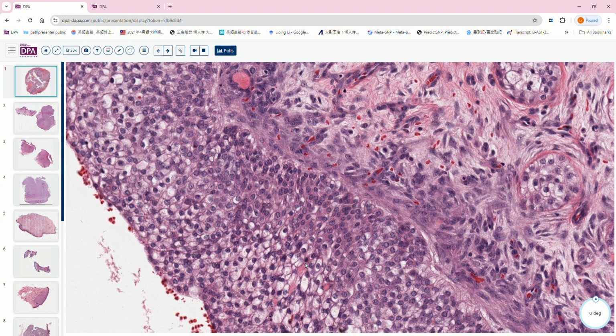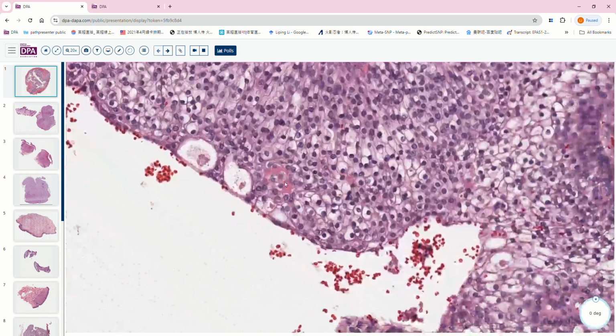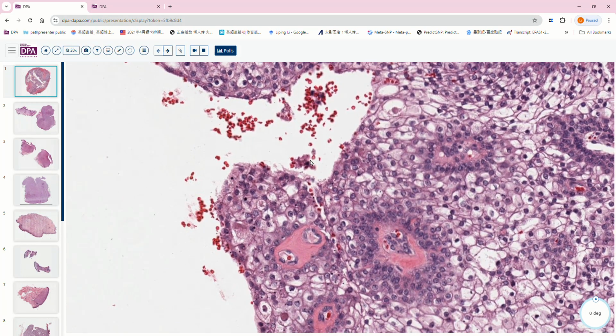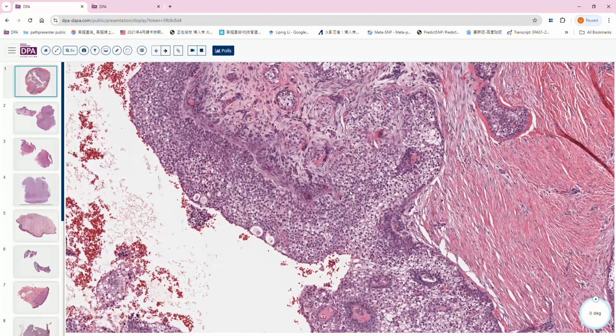And I want to see the duct here. Can you point out the duct? We usually have in this one the eosinophilic cuticles. So we talk about the clear cell feature, eosinophilic cuticles, duct present, and these are mostly in the dermis, not the epidermis, so this would be hidradenoma, a nodular cystic hidradenoma. Yeah, that's a perfect explanation.